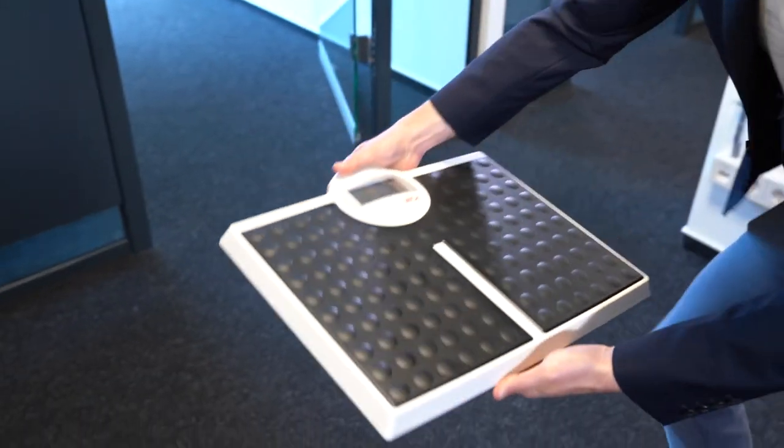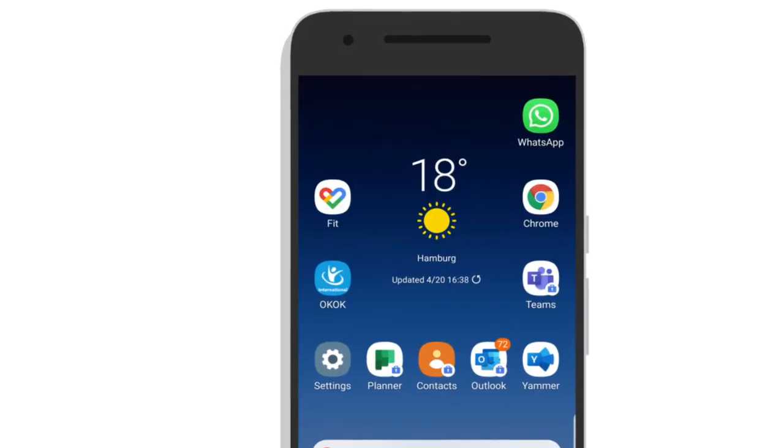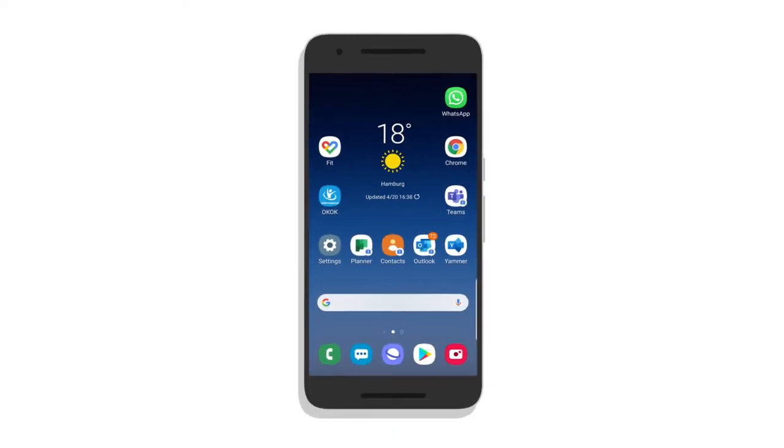Now I'd like to show you how easy it is to connect my Sika 813 Bluetooth to a mobile device. I download the OKOK International app — that's the app that connects the scale to my phone and stores it as a paired device.